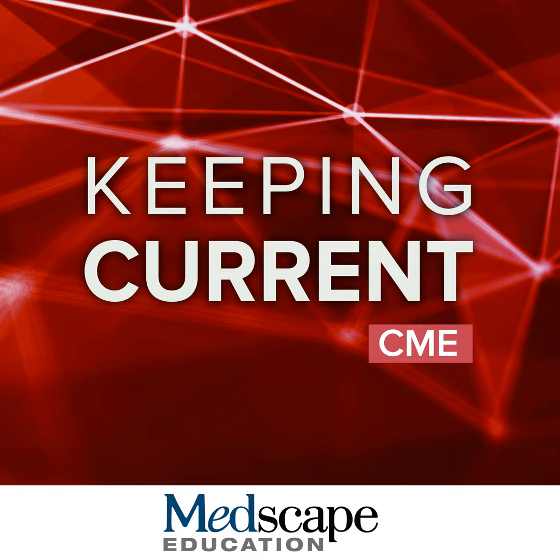So what are these hepatobiliary phase hypointense nodules without arterial phase hyperenhancement? If we look at patients who developed new classic hypervascular HCC and go back, anywhere between a third to 44% have these hepatobiliary phase hypointense nodules without APHE. If we go back the other way, when we start out with these nodules, up to 40% eventually turn into hypervascular HCCs, as opposed to nodules which are hyperintense on hepatobiliary phase, only up to 4% will end up becoming hypervascular HCCs.